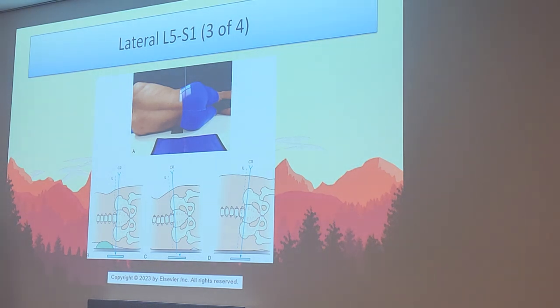All right, there's some of those variances, guys. That's what Mr. Fong was talking about, how you can slightly change the angulation by the shape of the hips. I will tell you, this is not going to make that much of a difference. This is extraordinarily subtle.